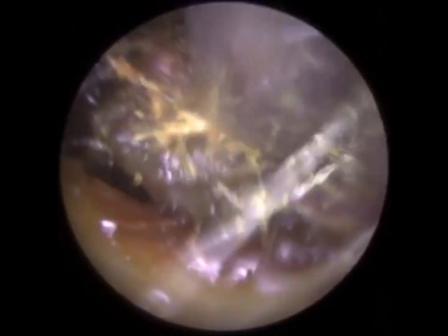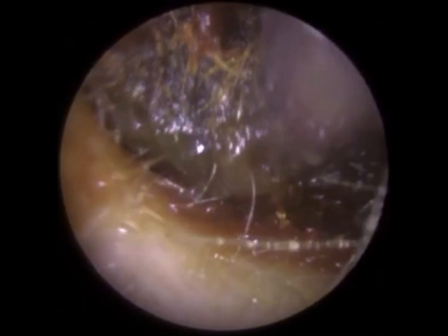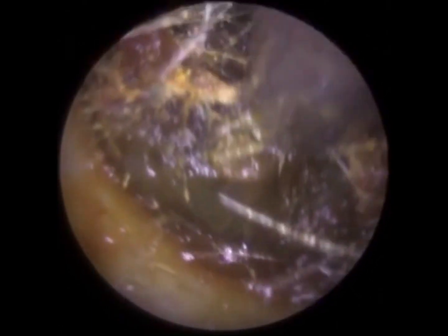Here you can see the Zolnir suction probe going quite deep in the ear, and I'm trying to release the wax off the eardrum, which I just managed to do there. As I completed that last part of the procedure, the patient found instant relief because this was compacted against the eardrum. The secret is, if possible, to get the wax off the eardrum initially — that makes the removal of the rest of the plug quite easy. You couldn't do that with the jobson horn because you would have to get in behind the wax, which would mean making contact with the eardrum and would have been very uncomfortable for the patient. So I've just released this big plug; the trouble now is getting it out of the ear canal entrance, as the plug is a lot bigger than the entrance.